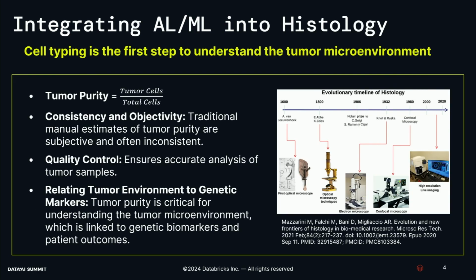We're good. So let's talk about histology. Histology is the study of microscopic structures, and it's historically been an analog field. We have actual microscopes, actual tissue, actual slides, and that really persists to this day. Most leaders in a pathology lab would think that storing a digital image would be more costly than storing the little slide in a warehouse. And they also have a duty to keep care of this thing for about 10 years.